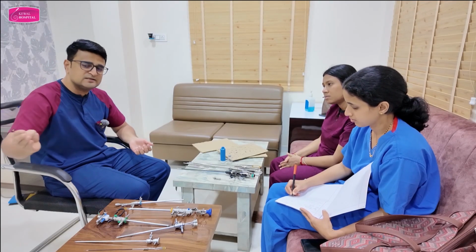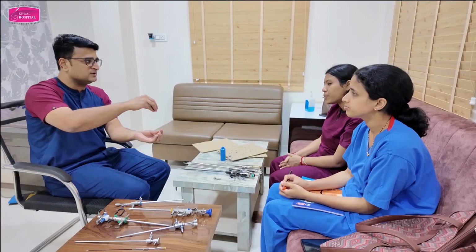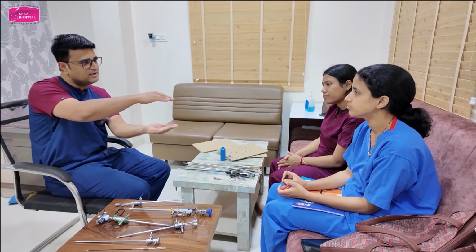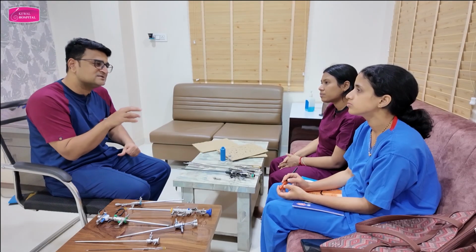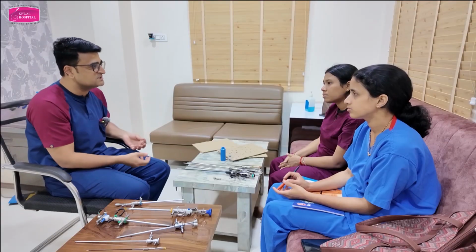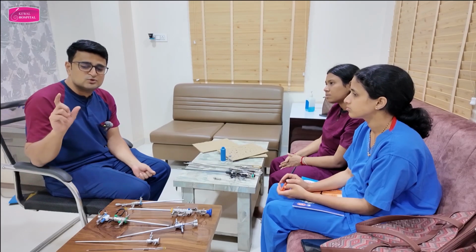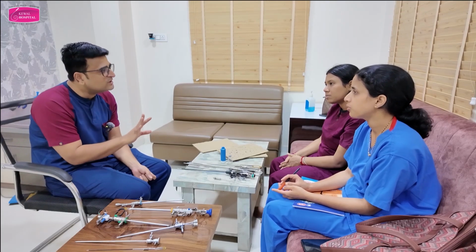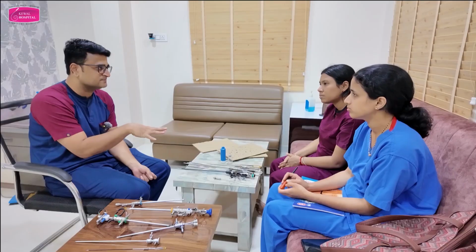So what we tell our assistant is, increase the pressure on the hysteromat so that more fluid will come and it will distend the uterine cavity. The moment you see the uterine cavity distended, you ask your assistant to stop there. So sometimes the pressure required to distend the uterine cavity is 60, sometimes 70, sometimes 80. Sometimes I ask my assistant to increase more than 95 also, 110, 120. Why? Because there is a lot of fluid leaking out and I am not getting adequate distension. So you can ask your assistant to increase, because even though the machine is showing 120, inside pressure is not 120. So you are not supposed to worry. You got the difference between the machine pressure and inside pressure.